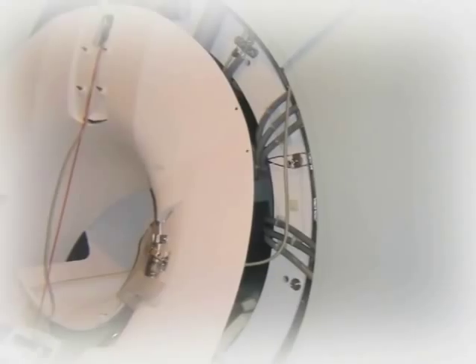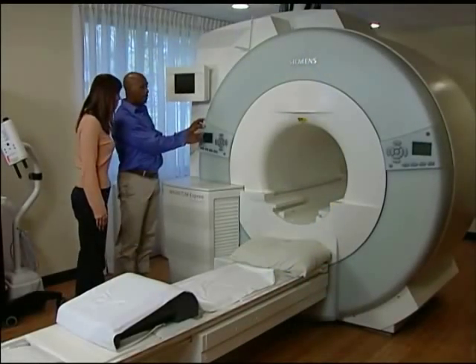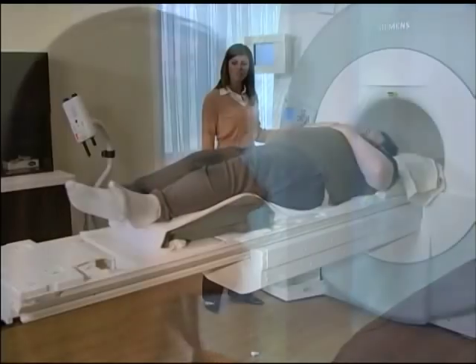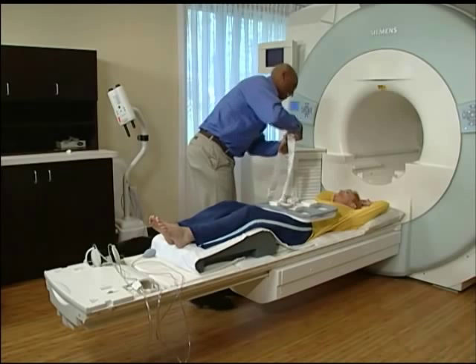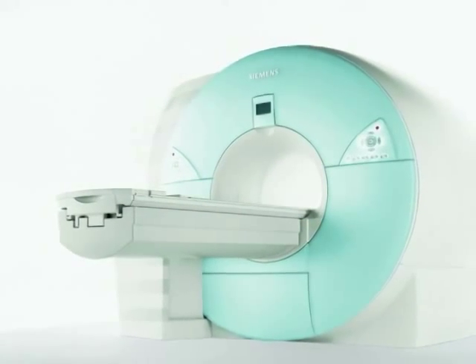This or similar accidents can also occur on your MRI system if you fail to observe the safety regulations. Safety training for all personnel entering the MR environment is a requirement. Such training ensures the safety of personnel and the patients undergoing MRI examinations. This video provides medical personnel with an overview of the basic safety precautions to be observed when using a magnetic resonance imaging system.